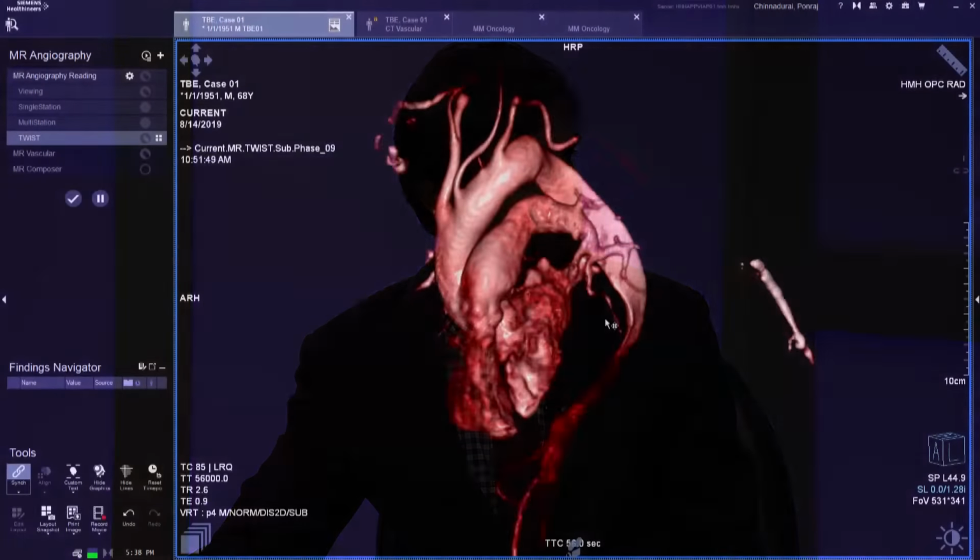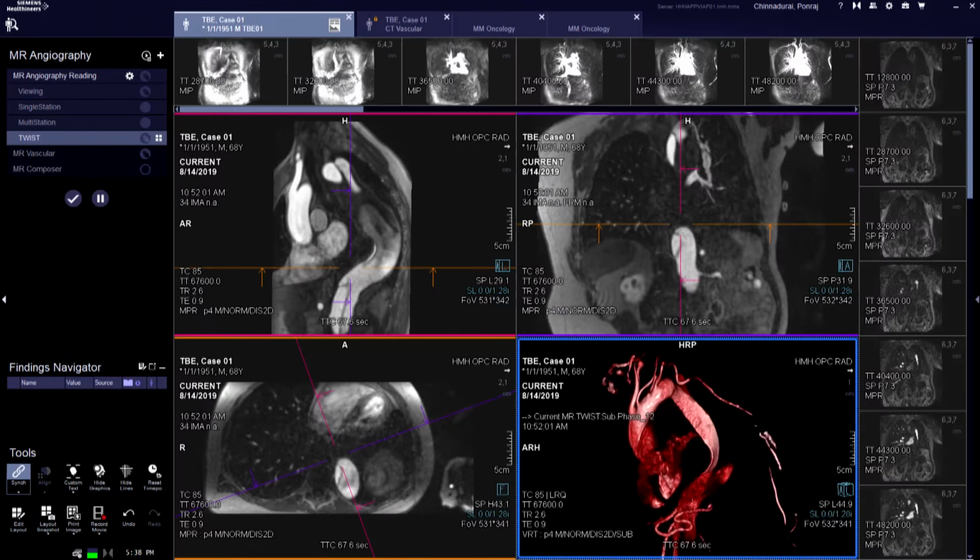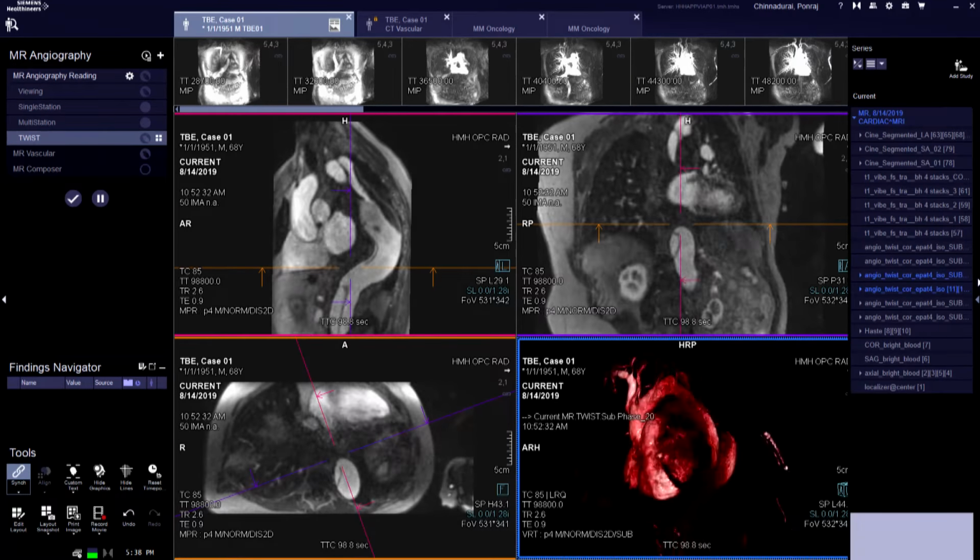And that's what I wanted to bring up: yes, there is an extra layer of learning curve for MR datasets, but for the effort that we put in, we get the dynamic information, the velocity profile, and there is much more we can benefit from these MR datasets, not just in terms of anatomy, but also in terms of flow. So the downside is they've got to lie in the scanner a lot longer. Sure.